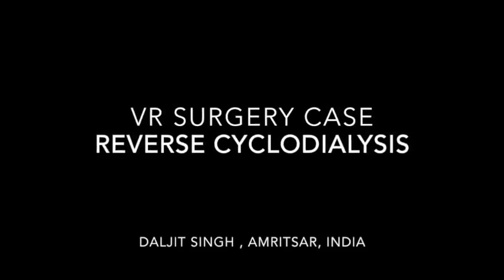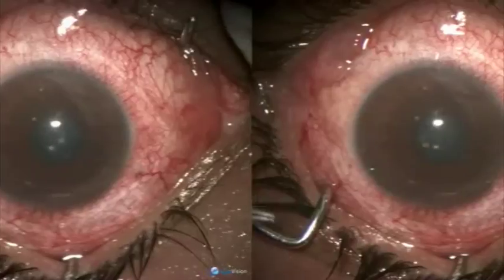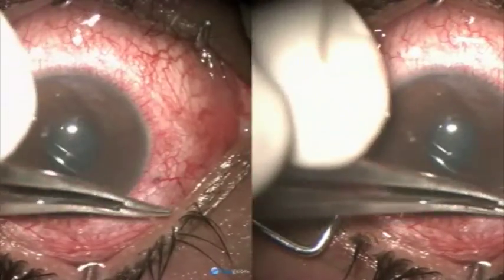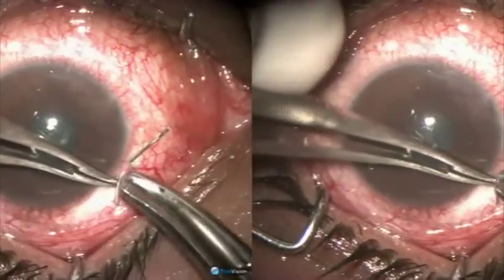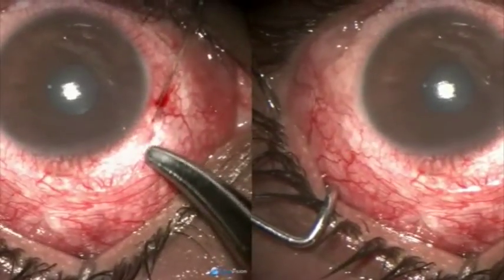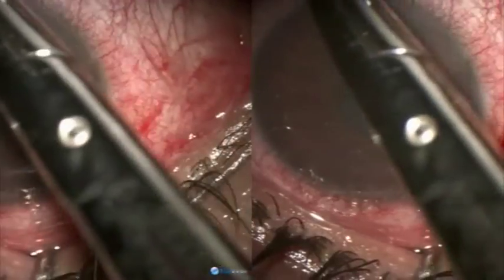A VR surgery case of failed glaucoma surgery, trying reverse cyclodialysis. As you can see, all the circumference of the limbus is scarred. At 12 o'clock you see a big scar from where the anterior chamber filtration was tried, but failed miserably.